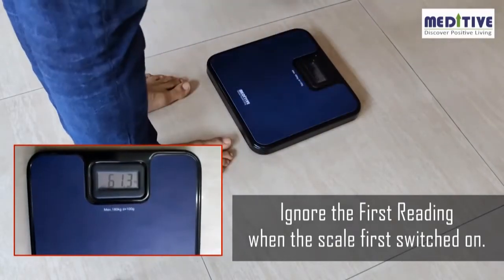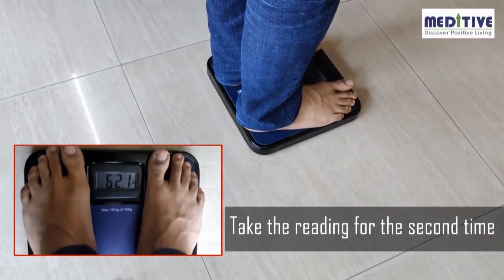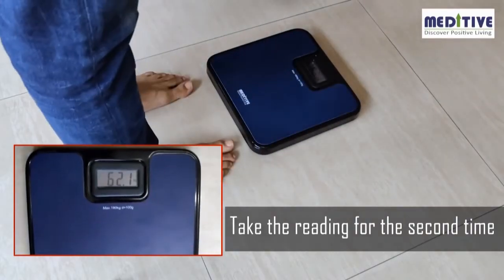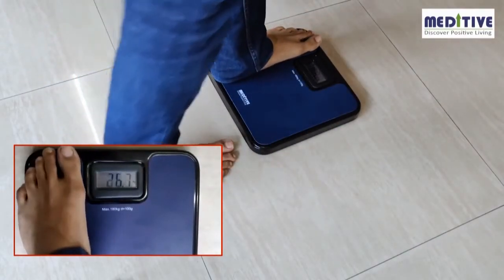Please note that whenever the scale is kept on the floor, the first measurement reading has to be ignored because the scale calibrates itself on the first reading. Please take the reading a second time without moving the scale, and then you will get the correct reading.